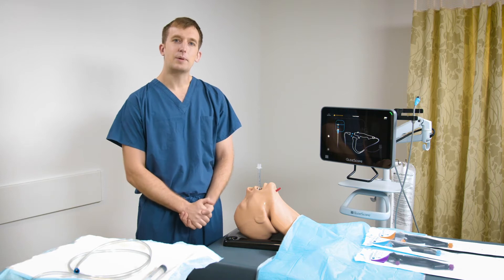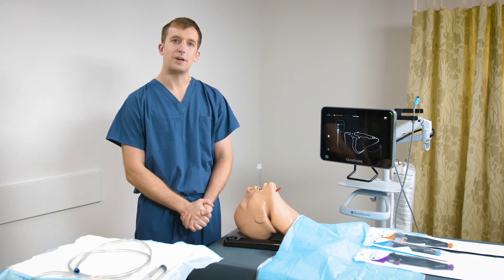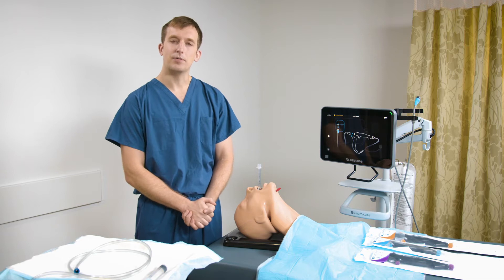Hi, I'm Dr. Rainer. Today I'm going to be talking about using the B-Flex single-use bronchoscope to perform suctioning of a patient's airways. The techniques shown in this video are mine. Please consult the operations and maintenance manual before using this product.